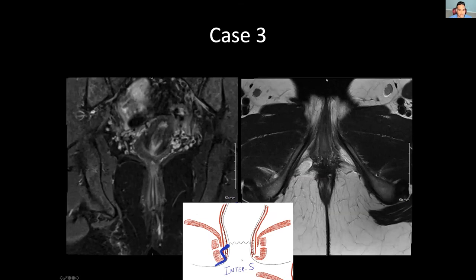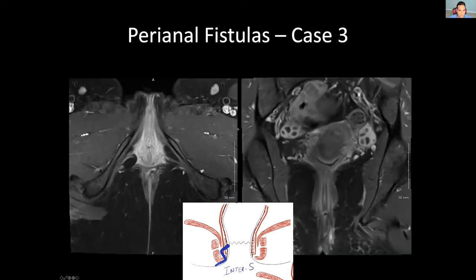Now let's switch to an inter-sphincteric fistula, case three. On T2, there's some signal in the left ischioanal fat, and importantly there is a small black dot visible in the fistula - that is a seton in place. The next image makes more sense: the fistula tract never goes beyond the external sphincter - it stays in the inter-sphincteric space. It is a low left inter-sphincteric fistula. On the axial plane, you can see it hugging the internal sphincter and never going further out laterally.